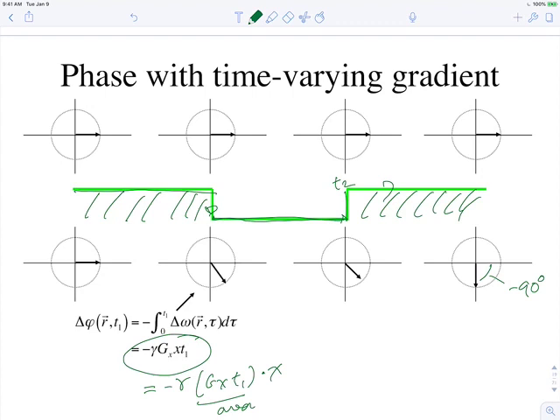Question? Just to be clear, we're assuming there's no relaxation at all. Yes, right. For now, there's no relaxation. We're in a perfect world. The spins just last forever. In a future lecture, we'll talk about what happens when they go away. Okay, so that's a great question. So the thing about MR, there's a lot of layers, and so we sort of have to present each layer at a time. But that's the reality is, yeah, nothing lasts forever. Okay.